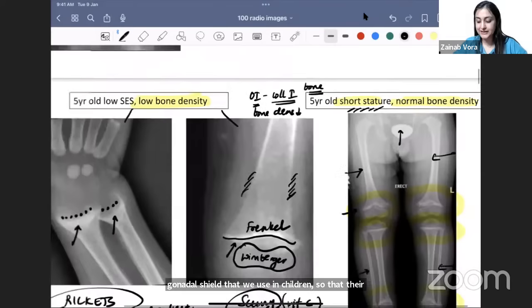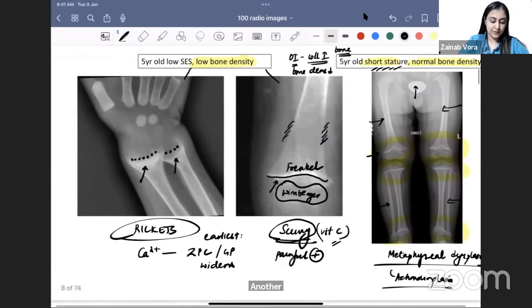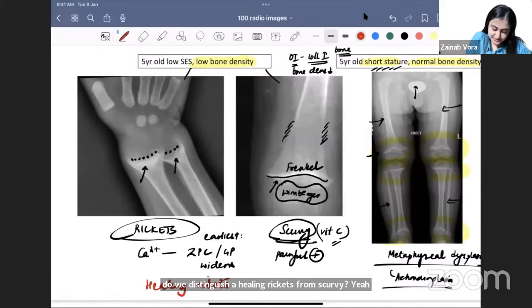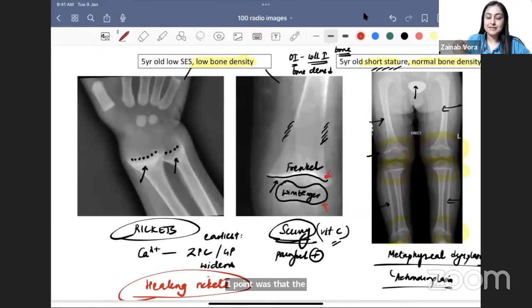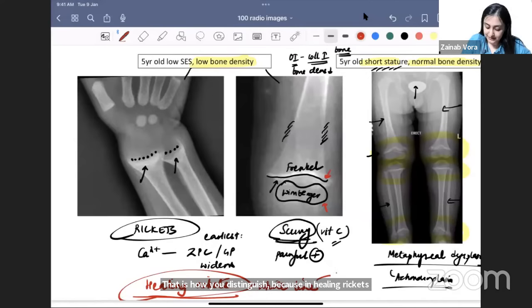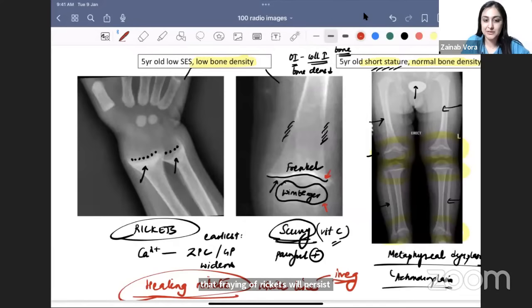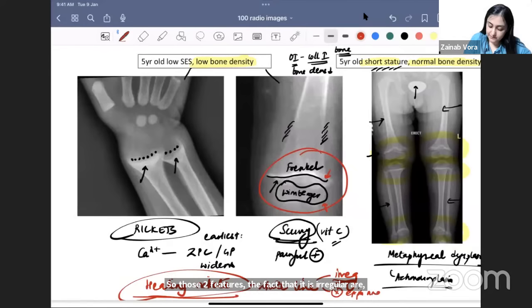The white structure visible in the image is a gonadal shield — used in children so that their testes don't receive radiation, as they are very sensitive. Regarding distinguishing healing rickets from scurvy: in scurvy the metaphysis is smooth; in healing rickets the metaphyseal white line would be irregular (fraying persists) and the Wimberger epiphyseal ring sign would not be present.